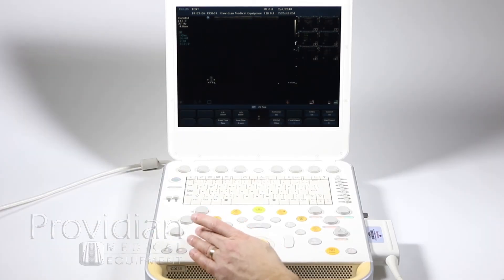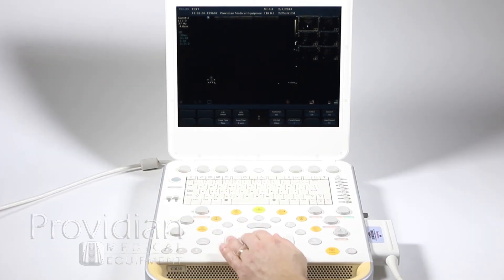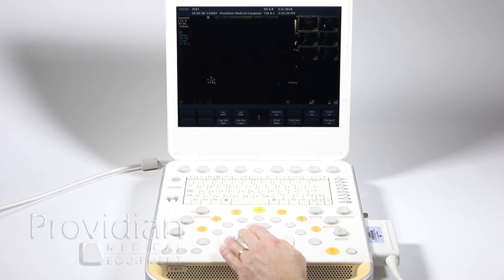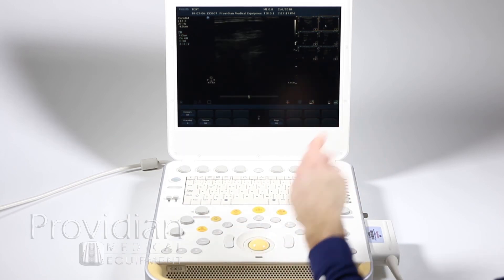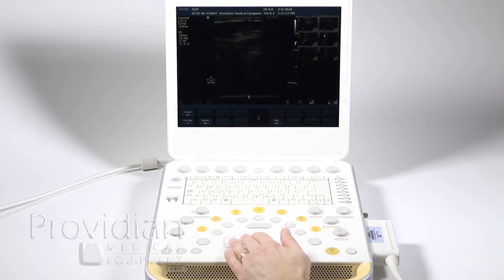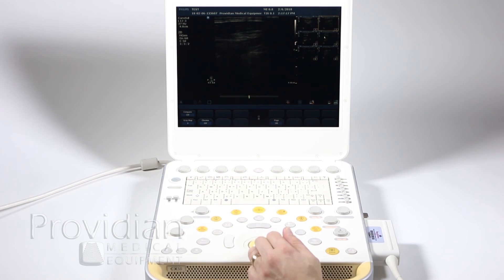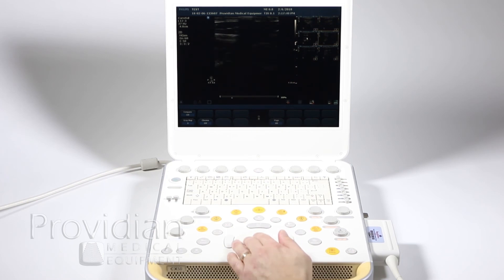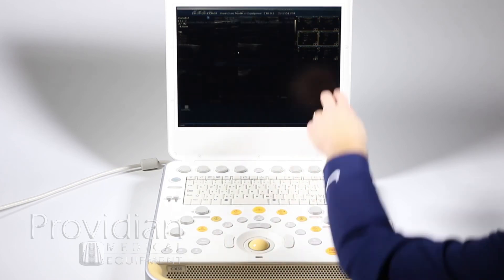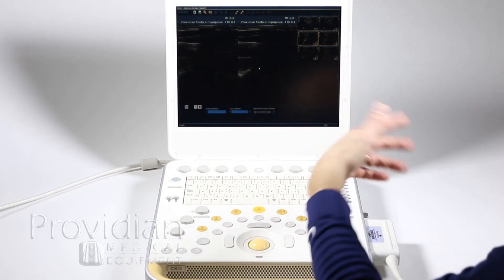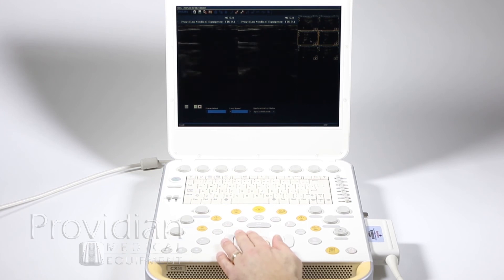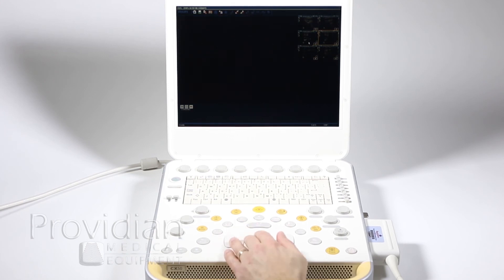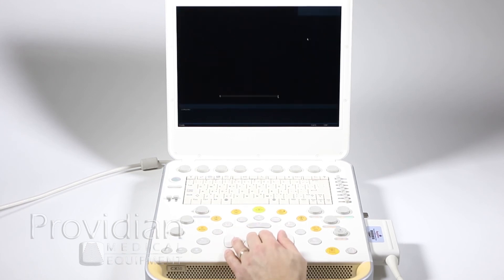When I use my pointer and come over here to click — if I double-click quickly on the second one, it's going to pull it up. But if I just left-click slowly, it's going to select both images and put them side-by-side instead of just allowing me to select one at a time.